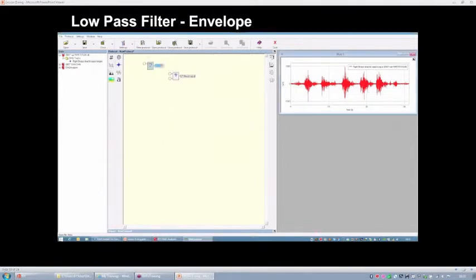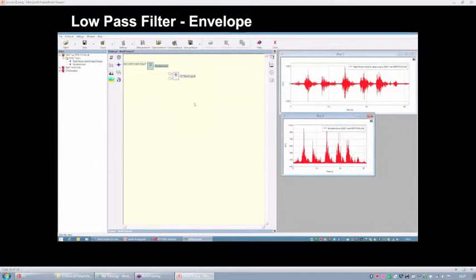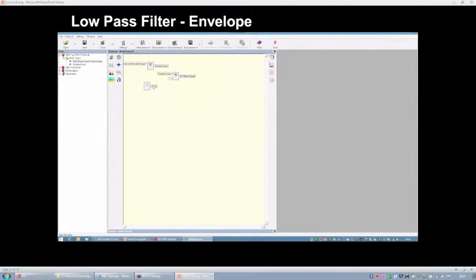the full wave rectification of the track, because you cannot use the raw signal as the input for the filter. You should remember from the first lesson how to do that and what's the meaning of the rectification algorithm. So the rectified signal will be the input, and then we have to define the cutoff frequency of the filter. It will be a low frequency. So for example, I will start by showing you the results with a 10 Hz cutoff frequency.